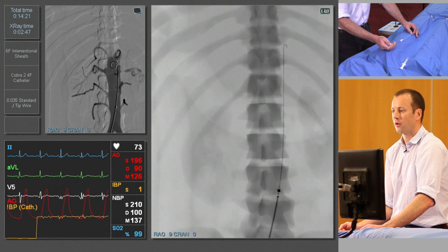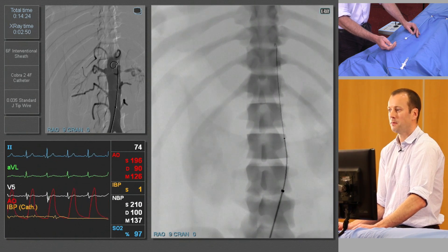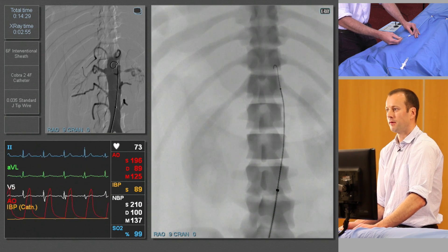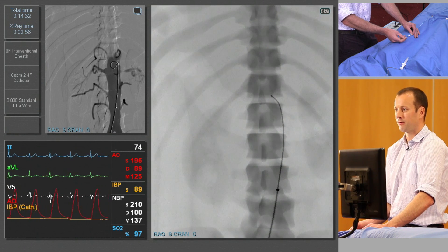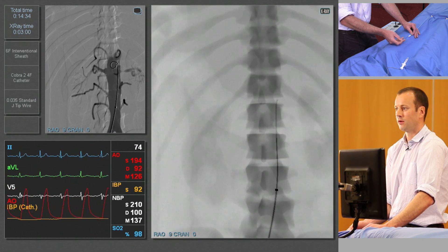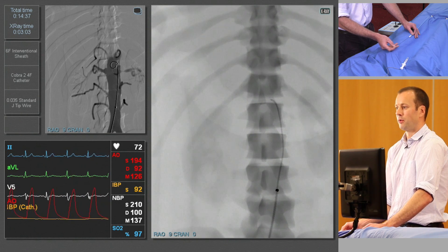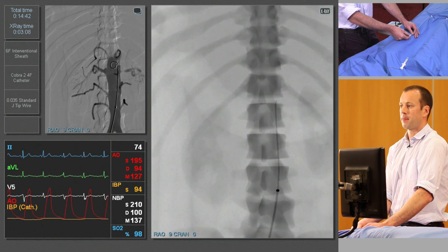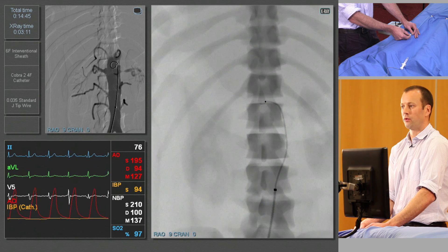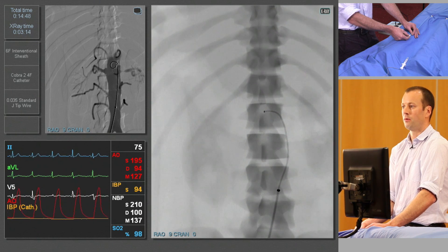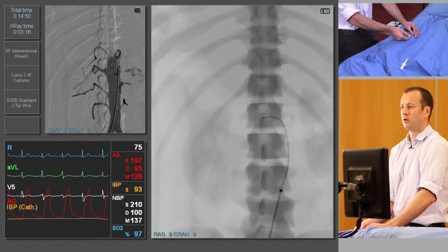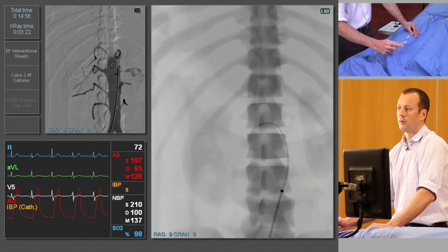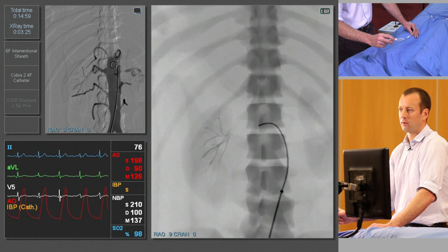We're going to take the tip of the catheter past the level of the renal artery ostium and then remove the guide wire. As always, basic principles: guide wire first when advancing catheters. We're then going to withdraw the catheter and hopefully engage the renal artery. We'll torque the catheter so it's pointing out towards the right renal artery and then just gently withdraw. We should see it just drop in — see the change in deflection of the catheter.